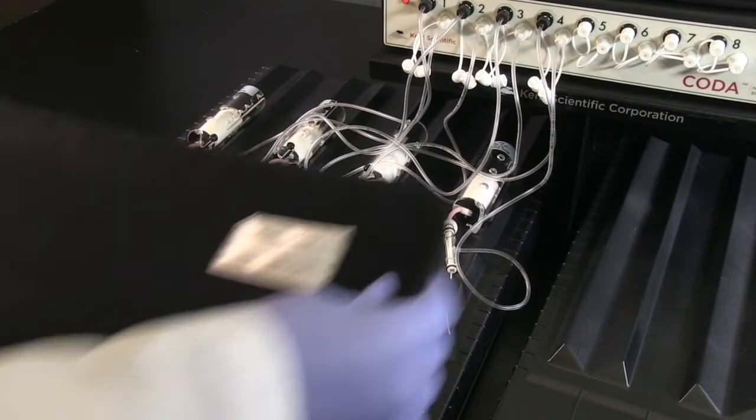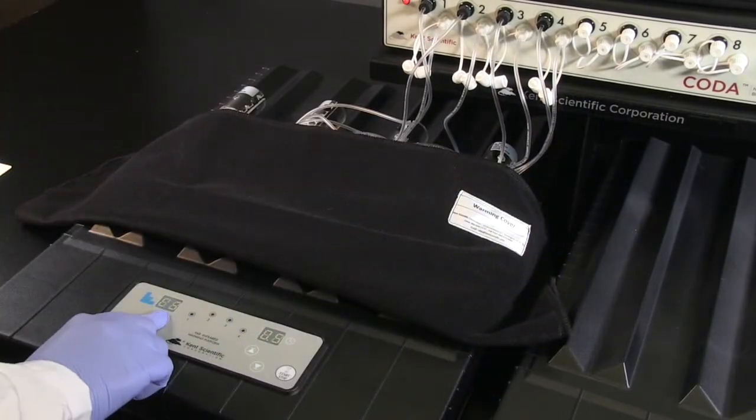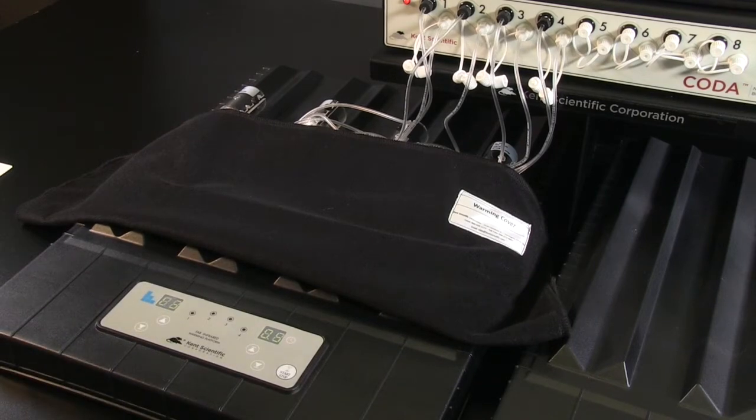Once both cuffs are placed, cover the animal's tails with the warming blanket and turn on the CODA warming platform to level 3. Warming is a critical step, as tail temperature is directly correlated to tail blood flow.